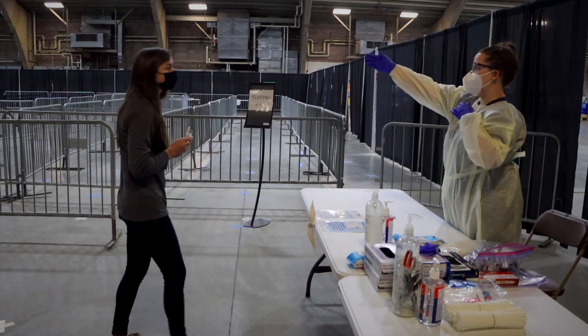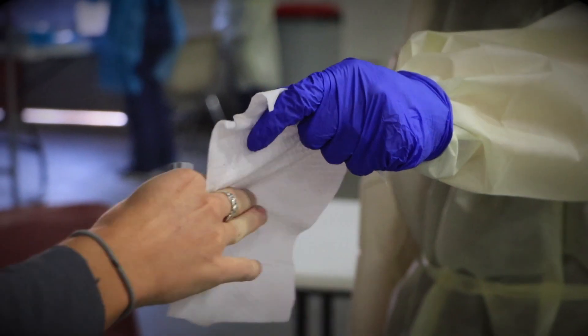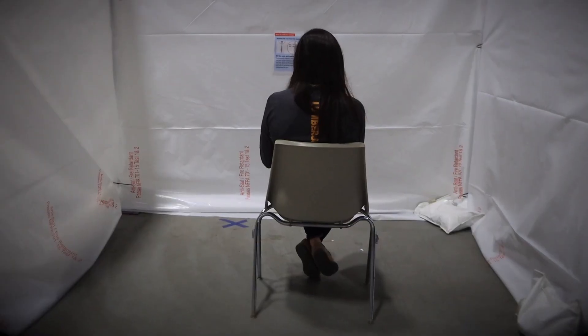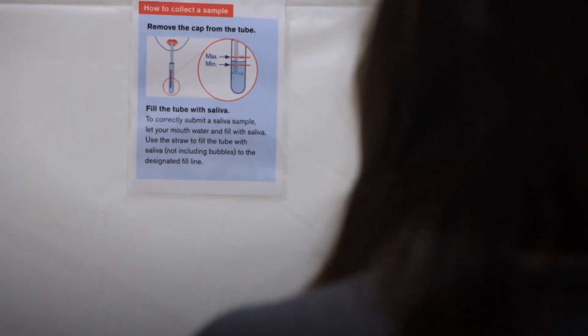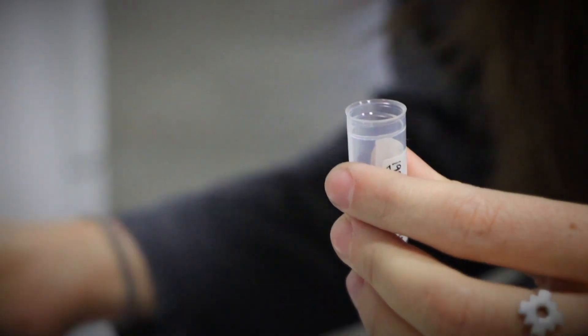Collect your items, then head to the testing bays. There, you will be greeted with a sanitized wipe and assigned a bay number. In the bay, you'll find a chair and written instructions on how to fill your saliva test tube. Unwrap the straw, place it in the test tube, and get to spittin'. Think citrus and sour candies to get your mouth watering.